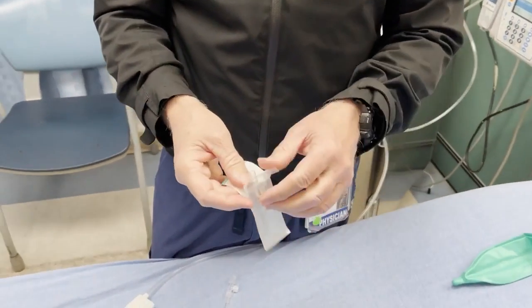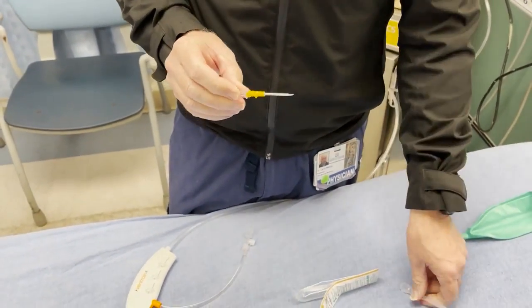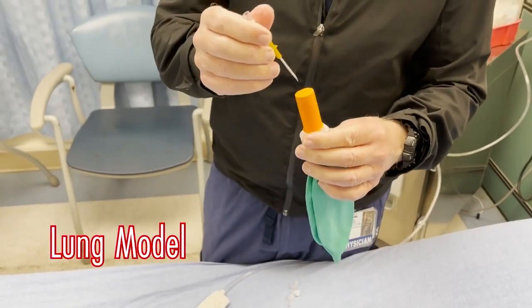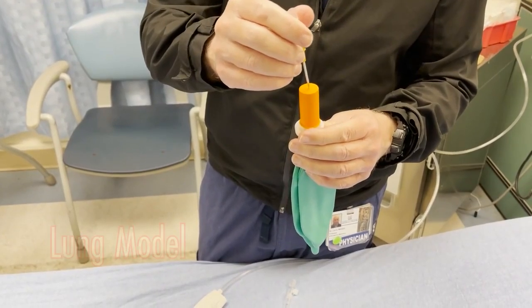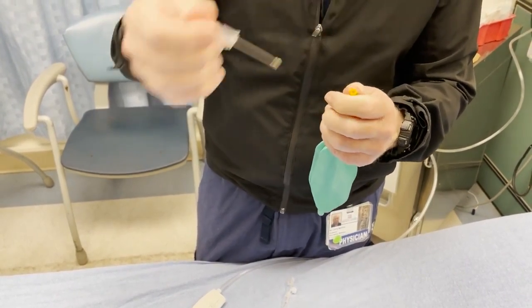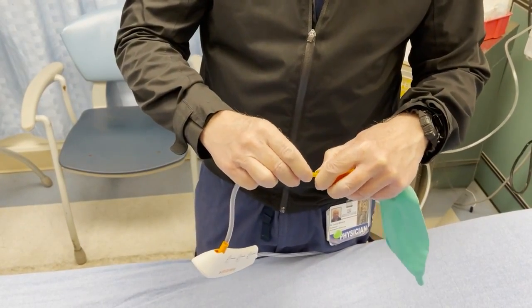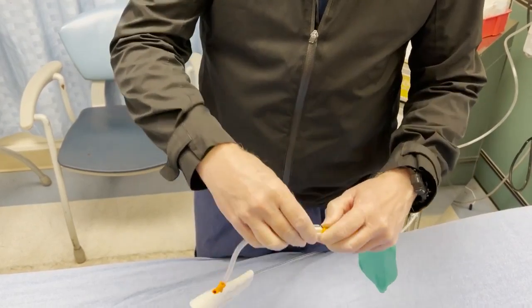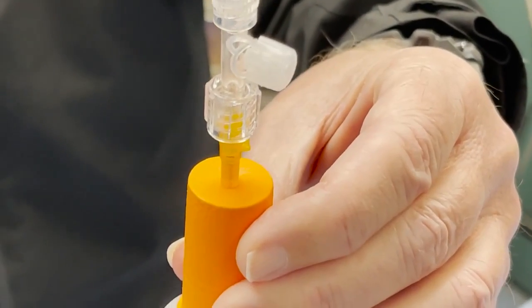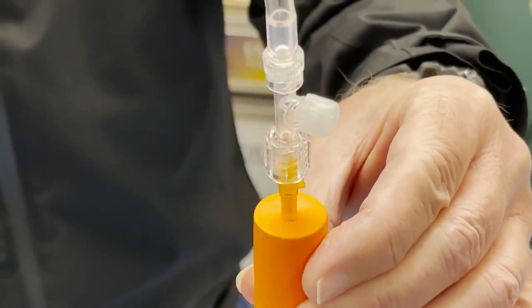What I'm going to do now is take this 14-gauge catheter and go into my lung model here. This is simulating going through the cricothyroid membrane. I puncture this, pull out the needle, and then hook up the Ventrain to my lung.